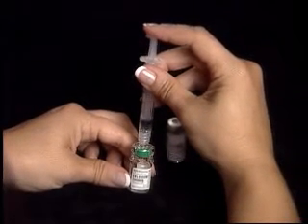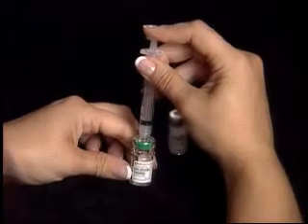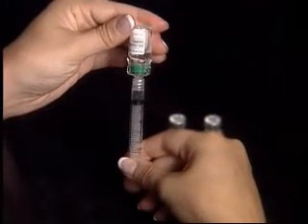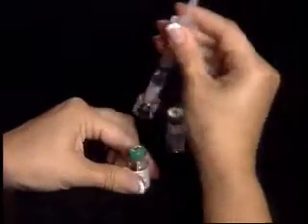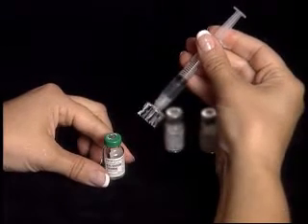Push until you feel a slight resistance, being careful not to pull down on the syringe plunger. Now push the syringe plunger down to transfer the air from the syringe into the vial. Keeping the syringe and Q-cap together, turn the vial upside down and pull back on the syringe plunger to withdraw 1 cc of diluent. Remove the Q-cap and syringe from the vial by pulling up on the syringe barrel.